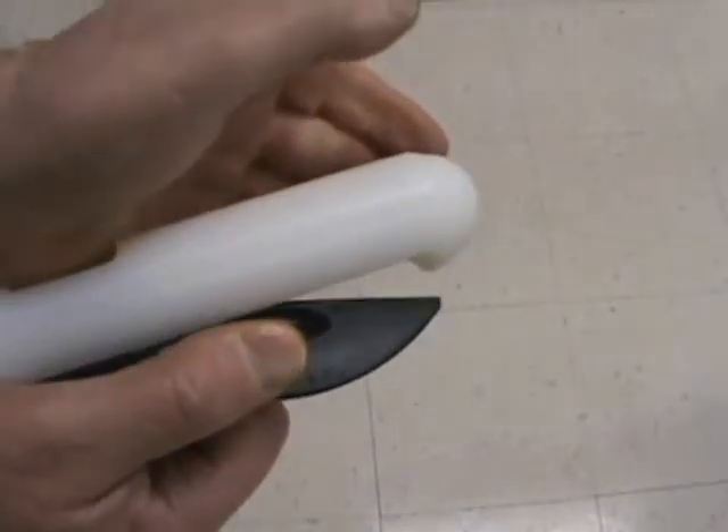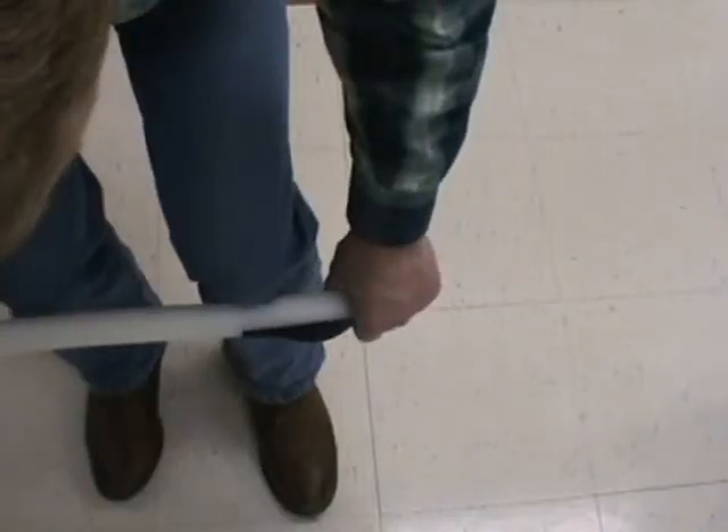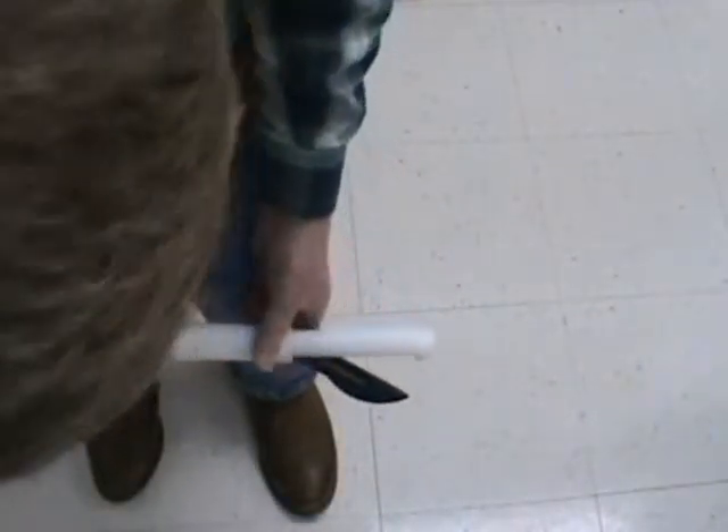Let's look at this video clip again — quite simple. Pull up, pull down. If it's sticky in there, try it over your knee pulling up. Sometimes it just pops out on its own.